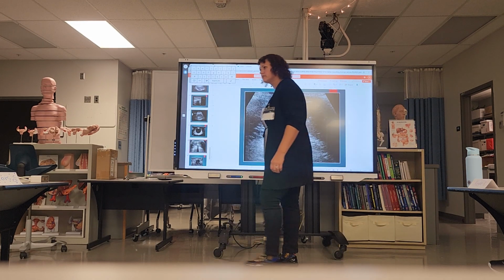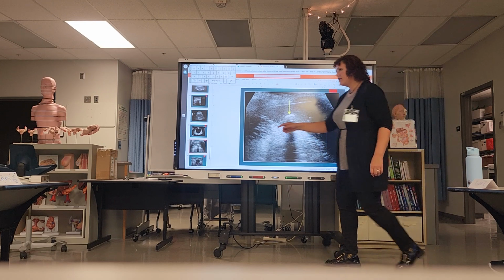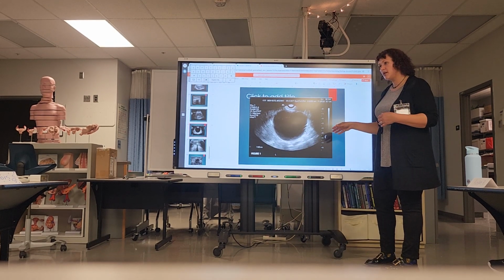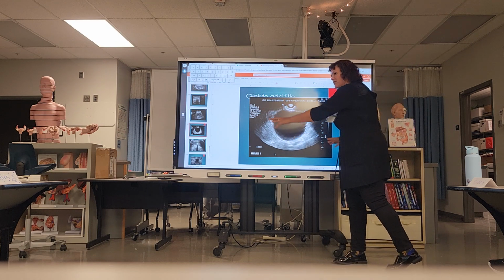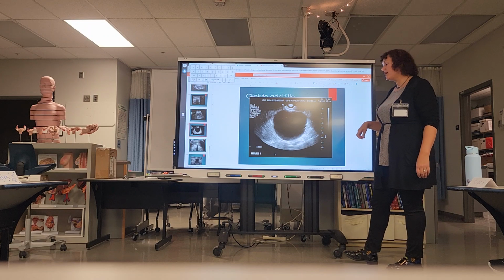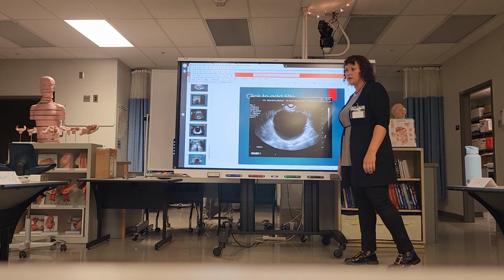Do you label artifacts, or is there anything wrong with them? You just change it and you avoid them? An artifact like this, yeah, we adjust our settings to try and get rid of it. Sometimes you won't be able to without sacrificing the integrity of the structure around it. Don't label it. You would write in your notes, artifact, appearance of artifact within the cystic structures.